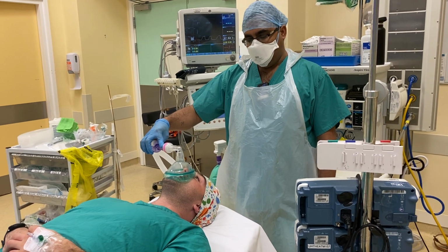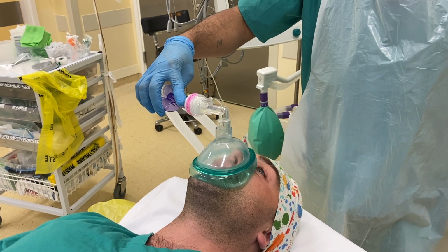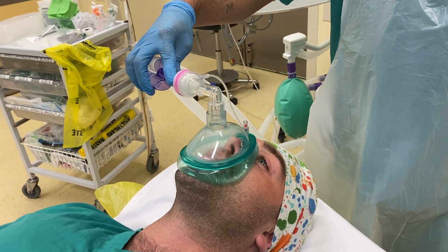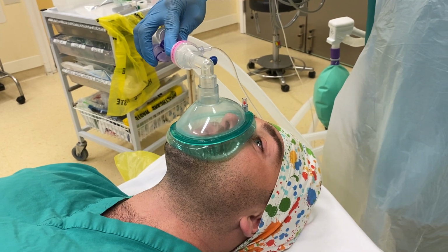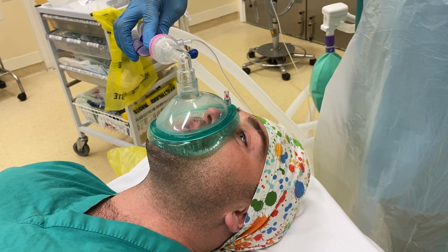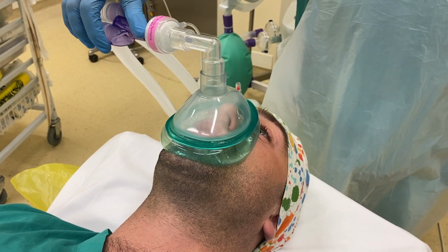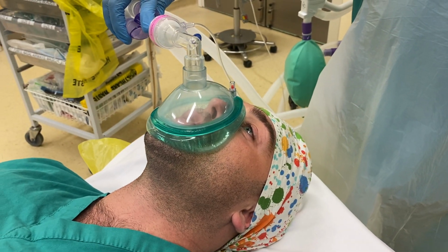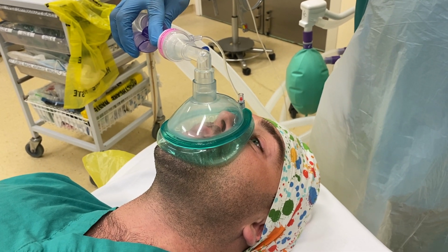This is our first option for holding a mask, and I'm just going to move a little closer now. So he's just holding the mask gently on Irla's face. You can see that the mask has got a nice kind of squishy air-filled cushion around it. It's over the bridge of Irla's nose. It's covering both edges of his mouth and it's covering his chin. You can see that as he breathes out, the mask is misting.